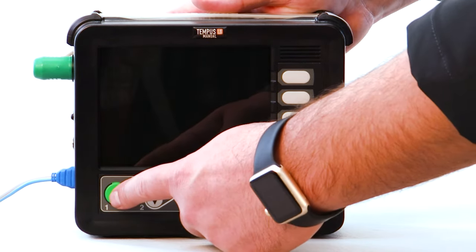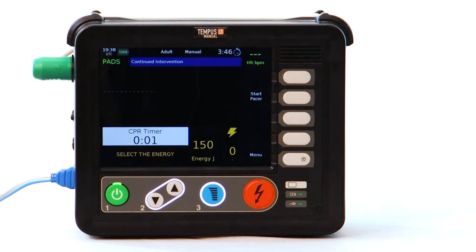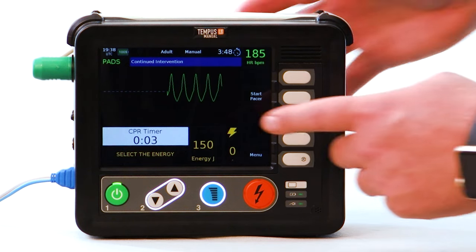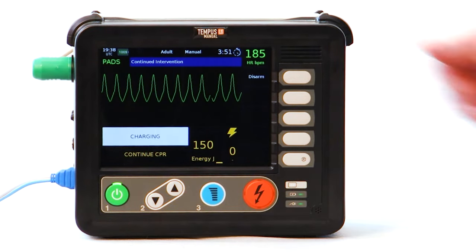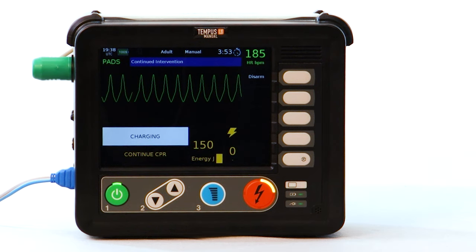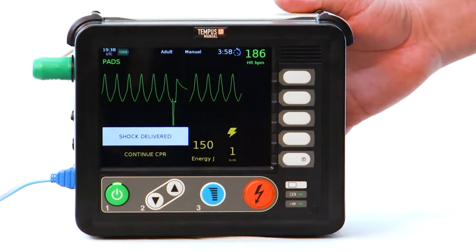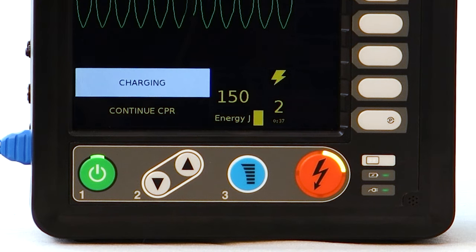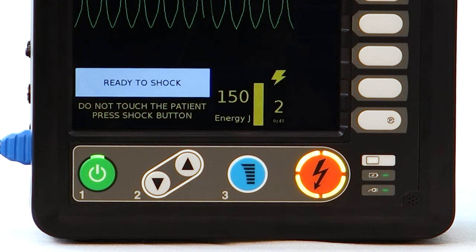The Tempus LS will power on in manual defibrillation mode for rapid therapy delivery. Once the energy setting is confirmed and therapy is initiated via the blue charge button, the user will receive three indicators that the device is charged and ready to deliver the shock: the yellow energy charging status bar will appear filled, there will be four solid indicator lights around the shock button, and the beep audible alert will change to a continuous tone.